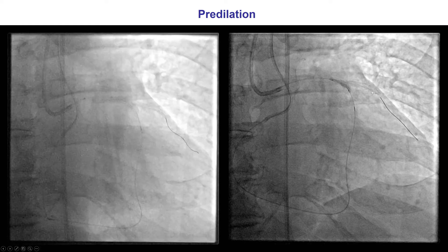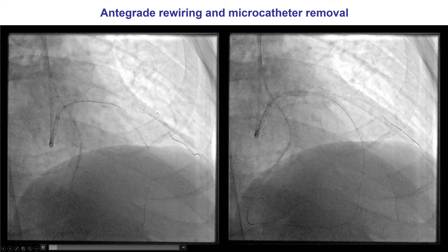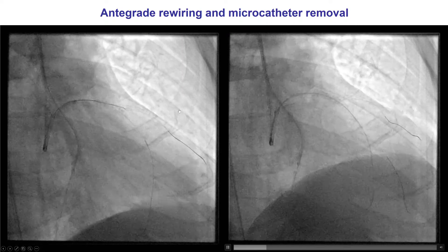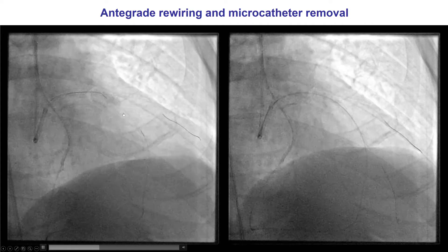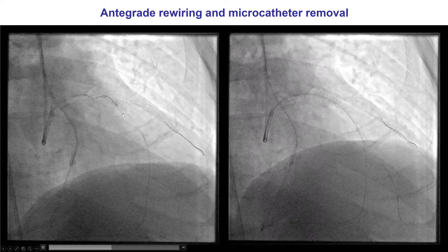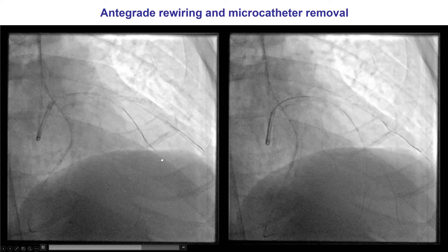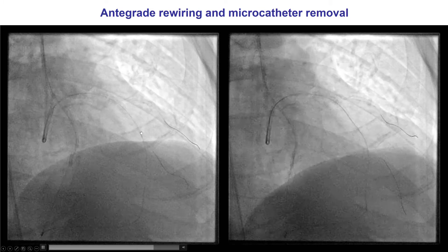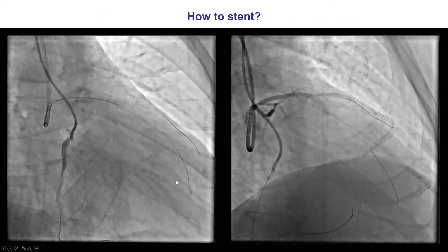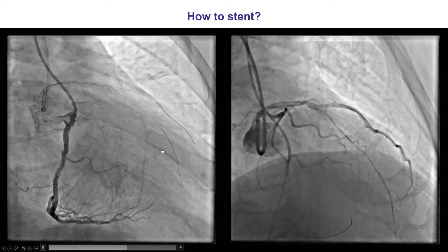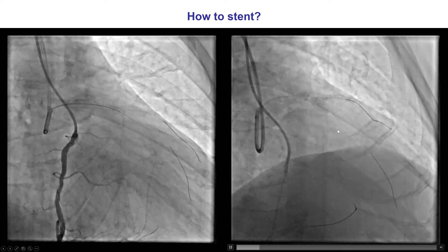The CTO was predilated and that restored antegrade flow into the LAD. Because we knew we had a complex bifurcation that would require two-stent implantation, we decided to remove the retrograde guidewire after advancing an antegrade wire into the distal LAD. We then removed the retrograde equipment and discussed how to stent this.